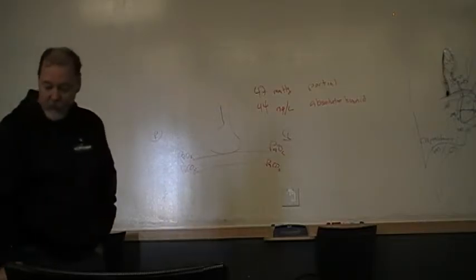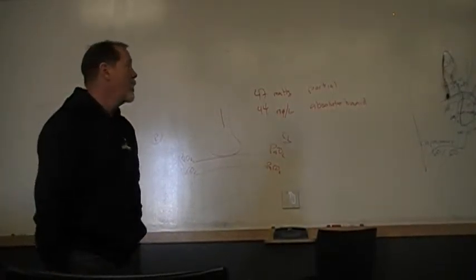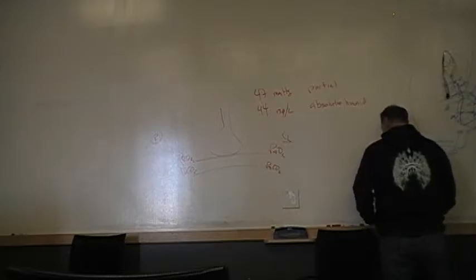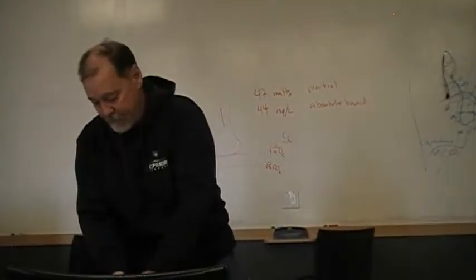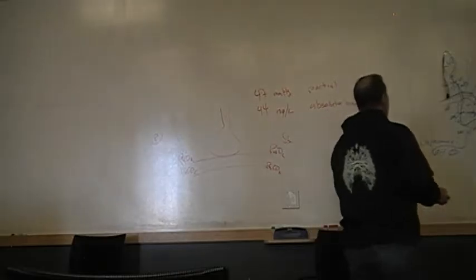Okay. Well, notice that there's a bit of a diagram beyond the pulmonary artery. So if we keep inserting this catheter, let me move this over so you can see it. So we keep inserting the catheter. The balloon's still inflated.